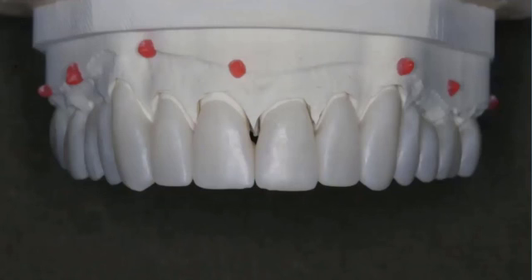And here's how they look on the model. Now, I know that right now these teeth are exactly where they need to be. We may go in and do some fine characterization. We may modify a few little items when it comes to shade or surface texture, little things. But I don't want to deviate from the plan, that is the imaging and the temps and now the final restorations.